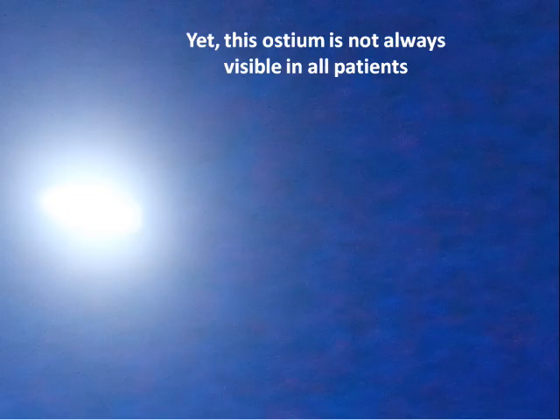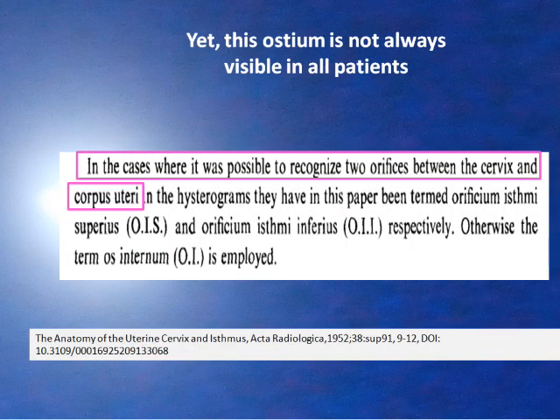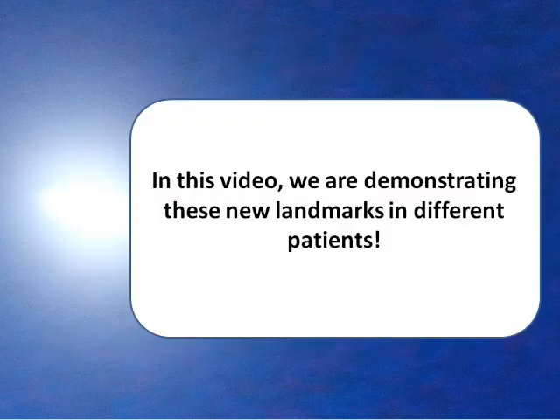Yet, this ostium is not always visible in all patients. In cases where it is not visible, the term internum ostium is to be used. In this video, we are demonstrating these new landmarks in different patients.